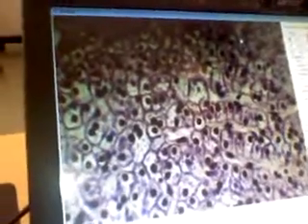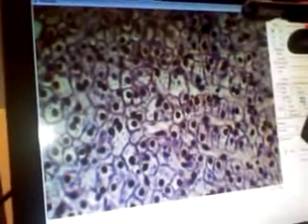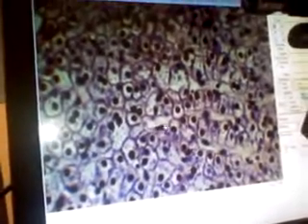And as we saw right up here, right there, we have pathways that lead into that central vein here. So these are hepatocytes along the side. That right there is in the actual lumen, isn't it? So that's a Kupffer cell right there.